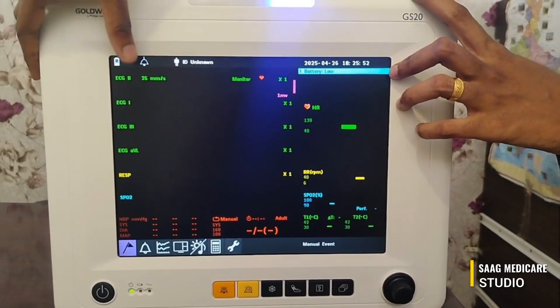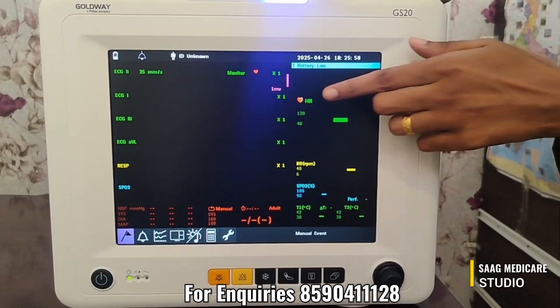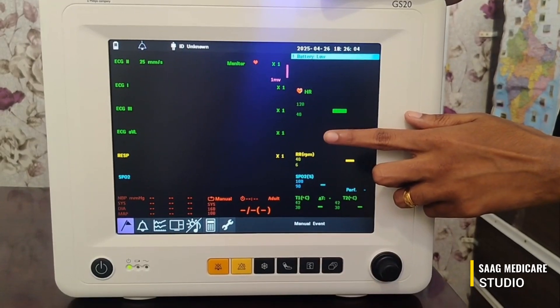Here we can see the ECG graph, the respiration graph, and the SpO2 waveform. Here we can see the numerical values: heart rate, temperature, SpO2, and respiration rate.